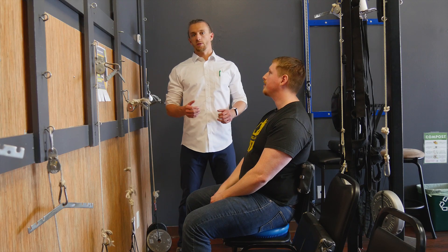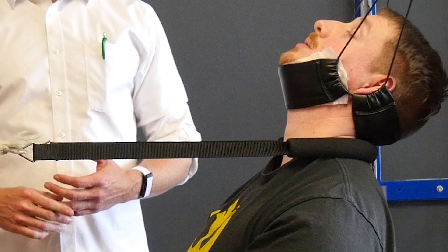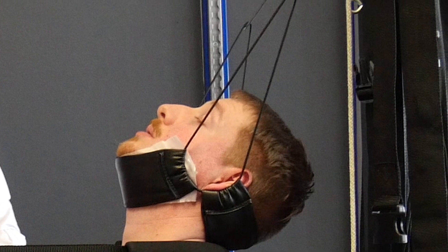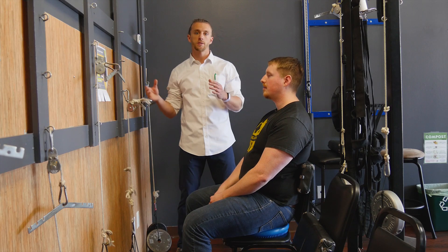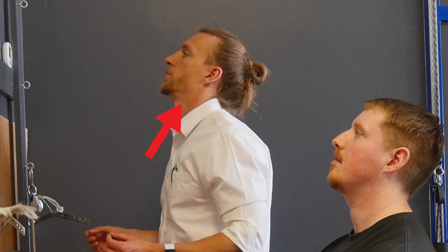What we're going to do with Joel is take a strap and pull into about the middle of his neck and pull forward into this wall. At the same time, we're going to hold his head in a harness-like position and lift up on the head back at about 30 degrees. This counterbalances that pull so we're not developing forward head posture, regulating that and bringing it back as we pull curve into the neck, thus increasing the cervical lordosis.